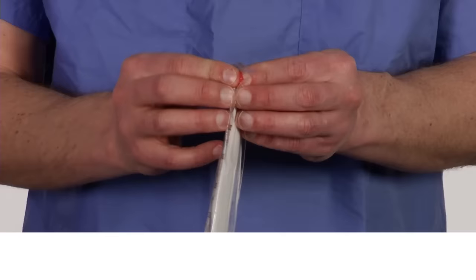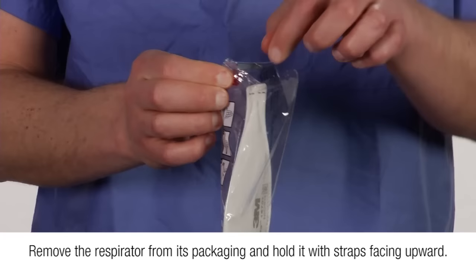The 3M 1870 Plus is a three-panel flat-fold particulate respirator and surgical mask. Follow these instructions each time you don your respirator in order to achieve a proper fit. Remove the respirator from its packaging and hold it with straps facing upward.